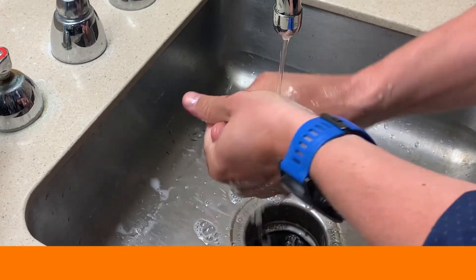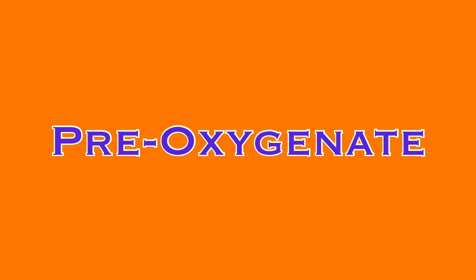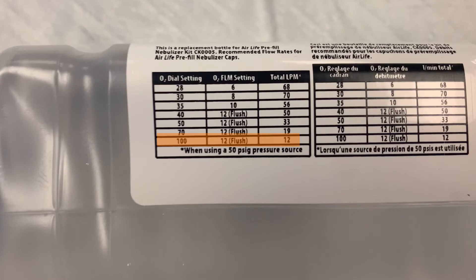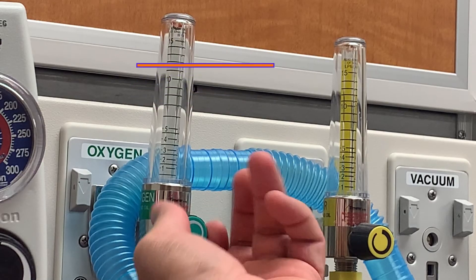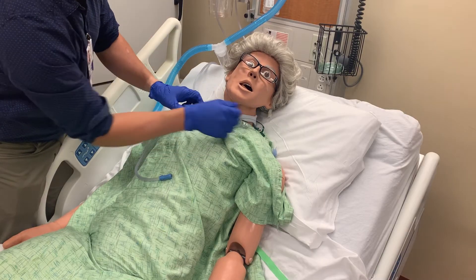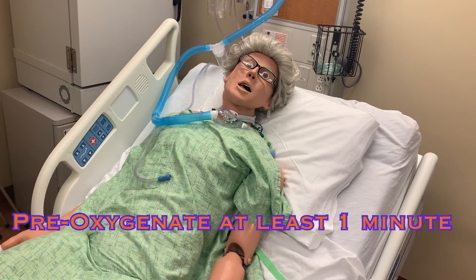With your supplies gathered, begin by performing hand hygiene and donning your mask and eye protection. Then you will need to pre-oxygenate the patient to avoid developing any hypoxia during suctioning, meaning supplying the patient with 100% oxygen prior to suctioning. Go to the venturi setup, turn the collar to 100% oxygen, and increase the oxygen delivery from the wall unit to the appropriate level. The table on the bottle shows that 100% oxygen requires 12 liters O2. Prior to increasing to 100%, be sure to note the original setting. After increasing to 100%, you can disconnect the snap on the side to make it easier to move the collar in order to introduce the suction catheter later. Pre-oxygenate for at least one minute.